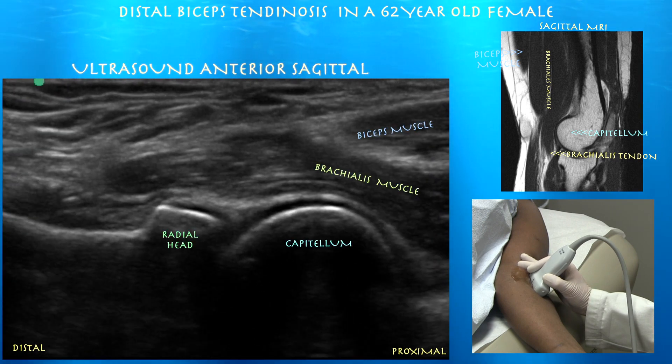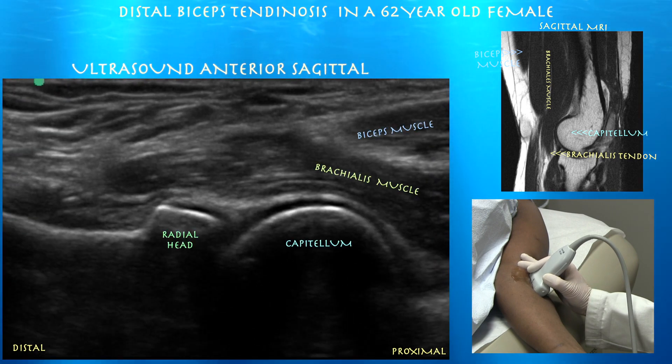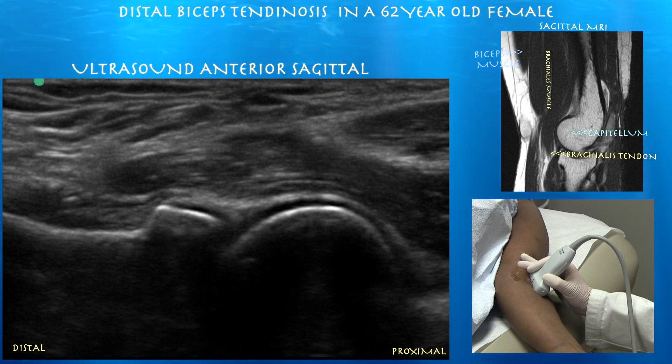Here's our radiocapitellar joint, and you can clearly see the radial head articulating with the capitellum. You can also see the overlying brachialis muscle as well as a glimpse of the biceps muscle.